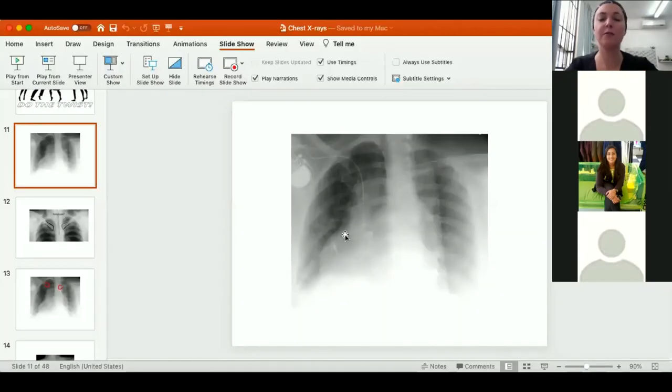Okay, so you'll find that with the pacemaker, it looks more like a computer, there's more little bits inside it. The defibrillation pad is usually just a square pad. So you'll see that it's going to be bright white. They'll both be bright white, but the pad should just be a square. This one usually looks a little bit more rounded, and usually it's got what looks like little bits of computer chip inside it. The pads, you should have two on. So if you're defibrillating someone or you're pacing someone, you should have one that's kind of right anterior, just underneath your clavicle, and you should have one that's on the left, kind of over what would be the apex of your heart.